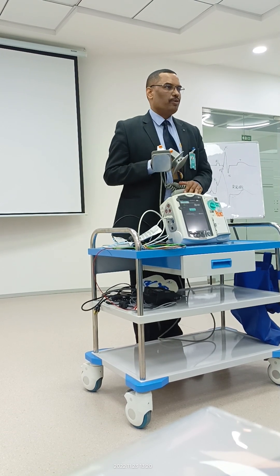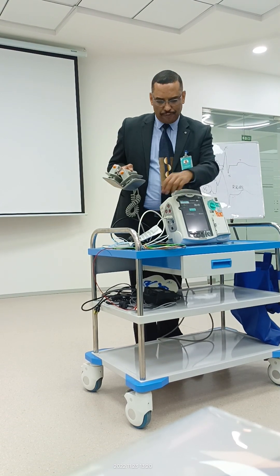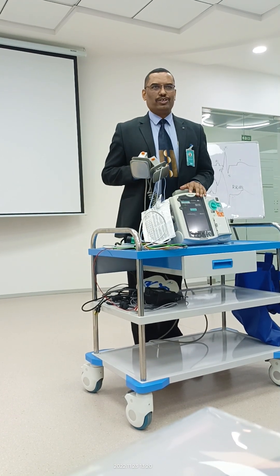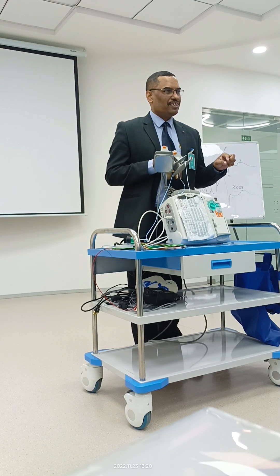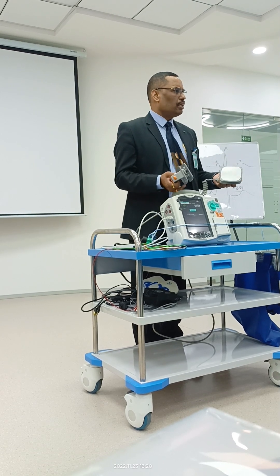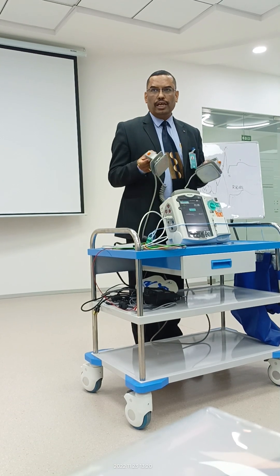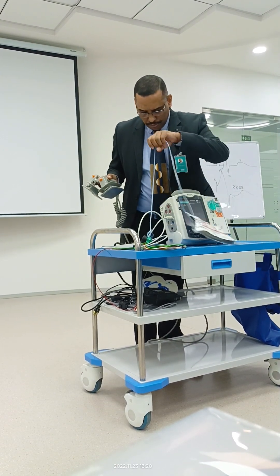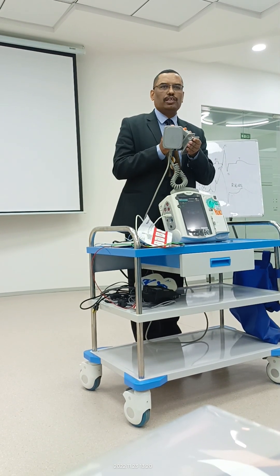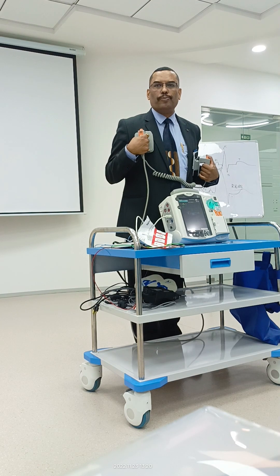This charge button on the paddle is operational only with pads connected — that's a safety feature on this machine. Other machines don't have that feature, so I thought it wasn't working. This is the latest machine and these safety features are always helpful. So the steps: this is a shockable rhythm — power on, connect paddles with jelly properly.